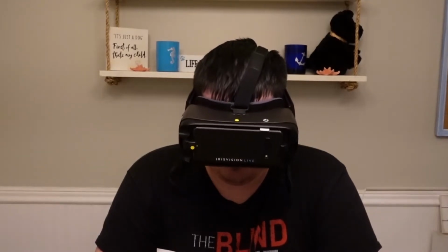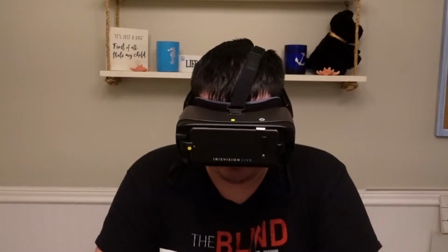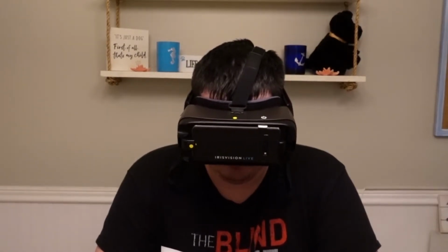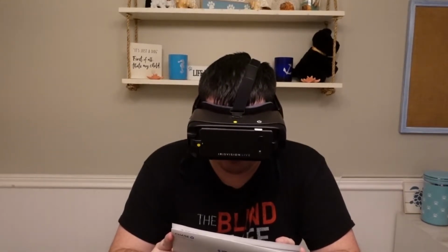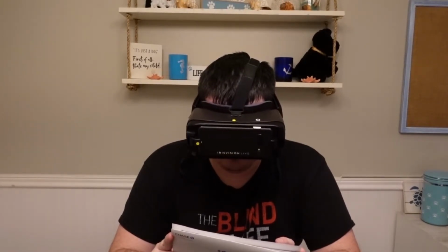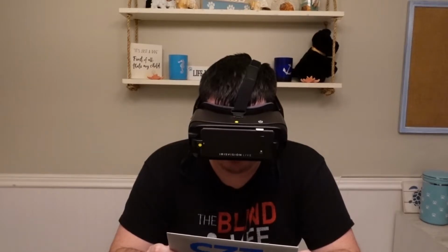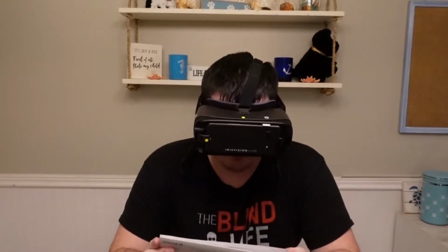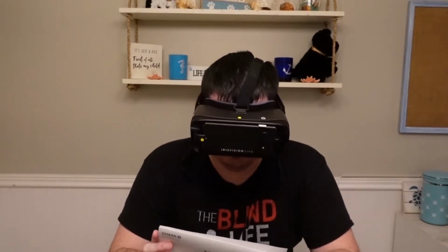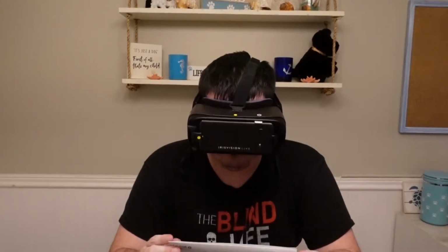It's not going to be for everybody, but I think it's bright enough to where it's not distracting, but it's also a little bit darker, so it's not that all white that's really straining on the eyes, especially for someone that has eye fatigue due to their visual impairment. And then, of course, the black on top of the color foreground really does stand out. It's kind of like everything's a bumblebee, to put it one way. But yeah, I like this one too.